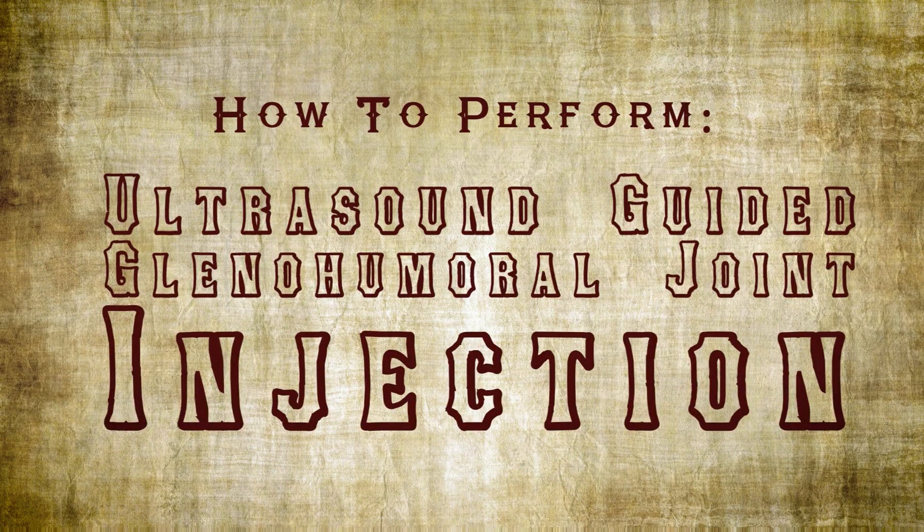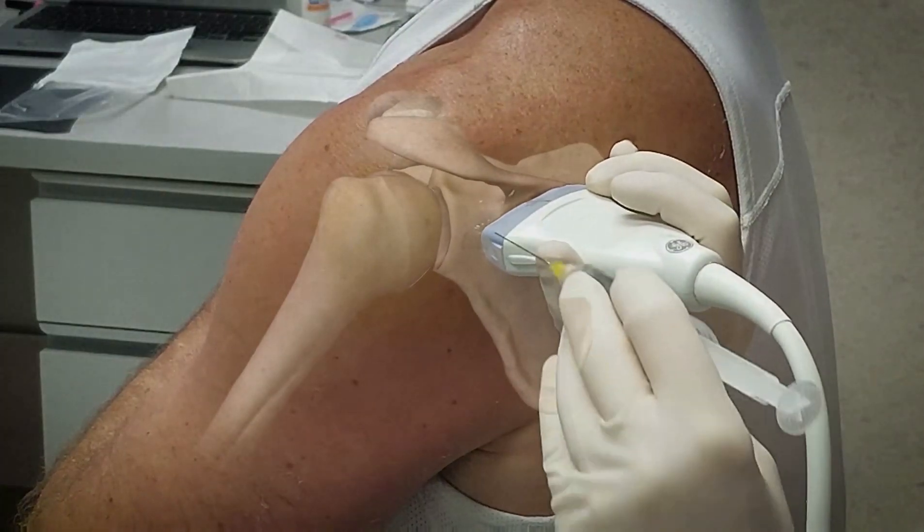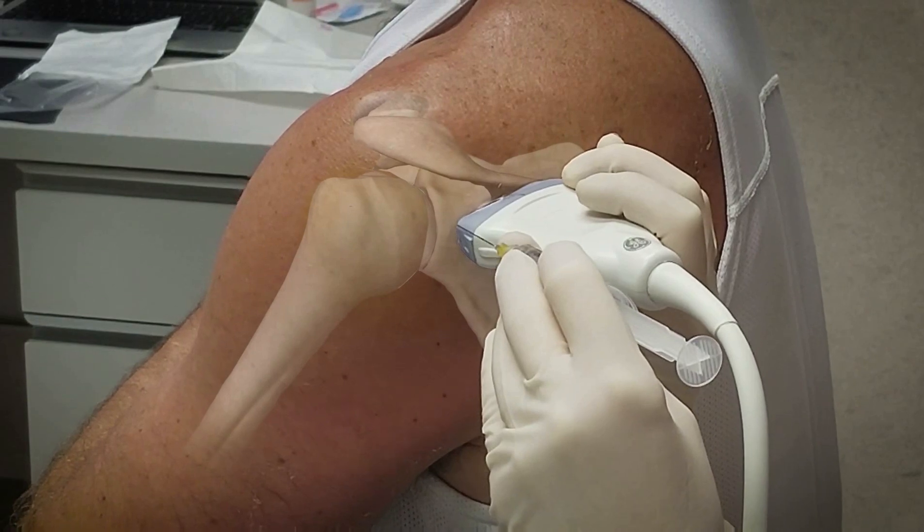The purpose of this procedure is to offer a patient relief from shoulder pain by introducing a local anesthetic and a steroid directly into the glenohumeral joint.